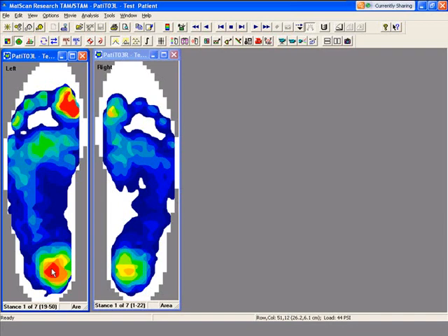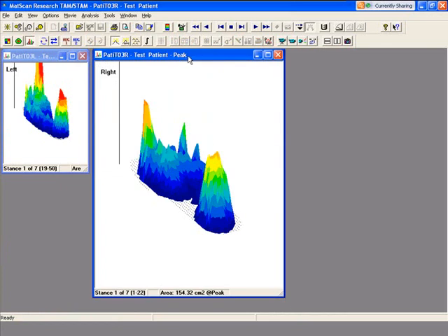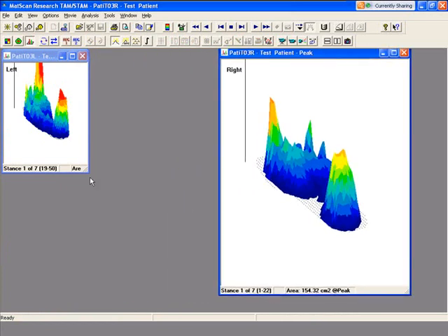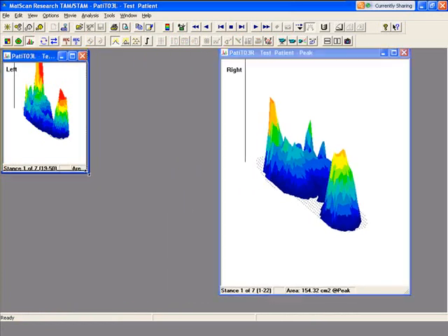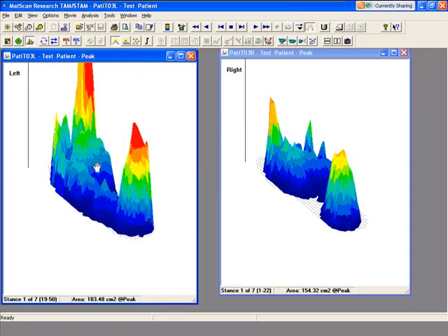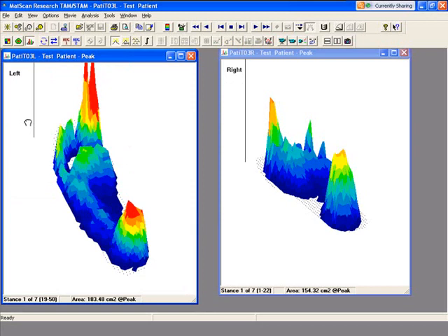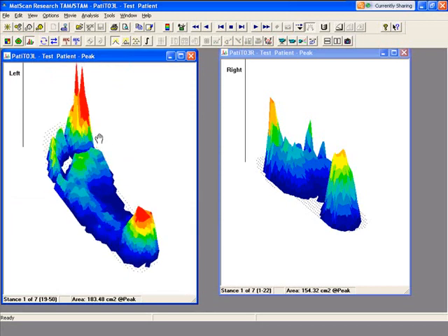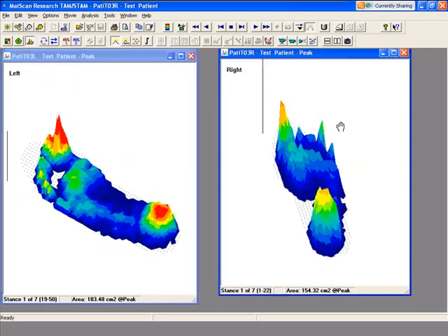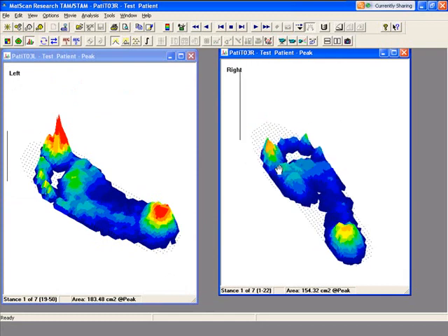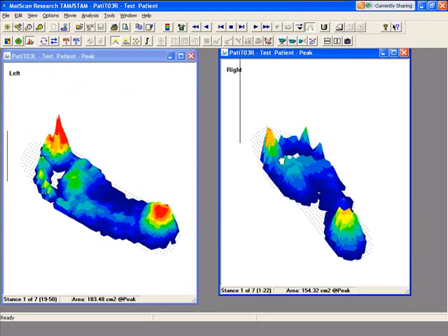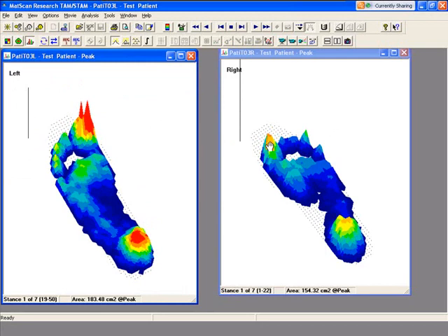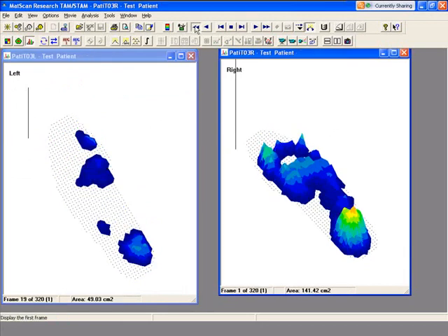The three-dimensional view takes the feet and puts it in a 3D view. What you can do is take your cursor and adjust the plane and the angle at which you can view the feet. You can also play it in this view as well.